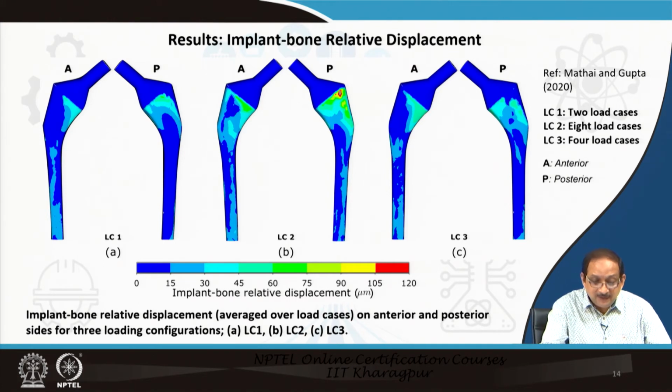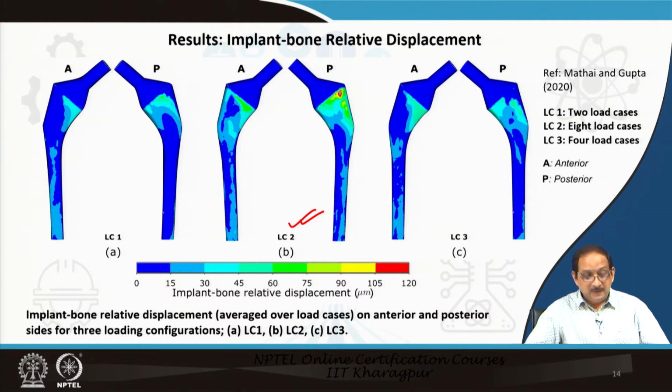However, in loading configuration 2, a relative displacement of 110 micron was observed at the posterior part of the implant.